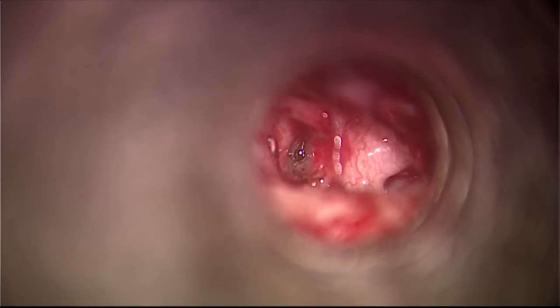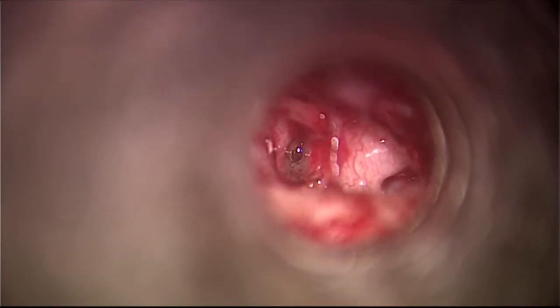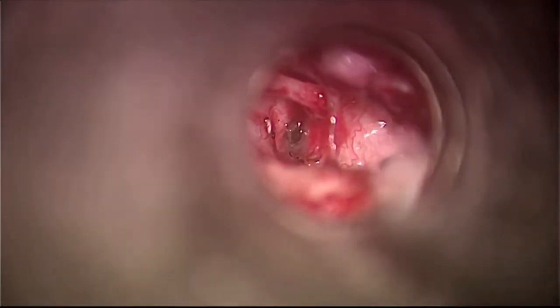But putting it very precisely at one point, so it's a calculated pressure and that force in your hand, that is what matters. That comes with time, obviously. I remember in one stapedotomy webinar, someone asked Ashish sir what to do if you have a floating footplate. He told, send the patient to one having a CO2 laser, do nothing.